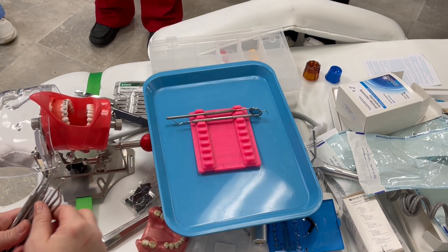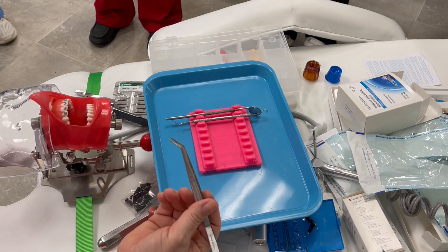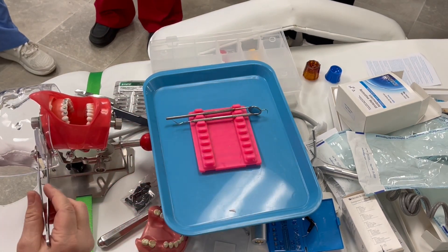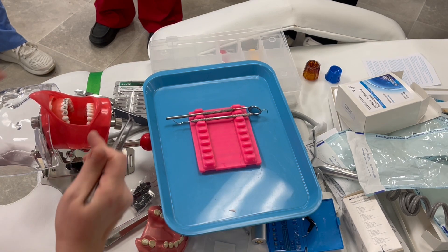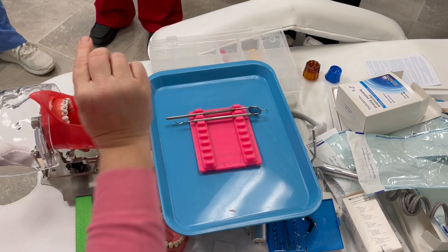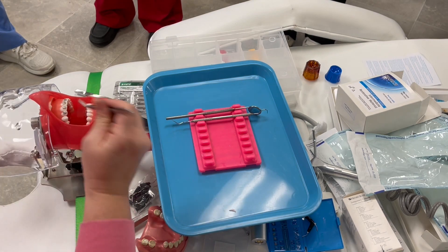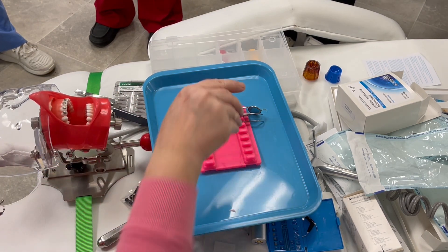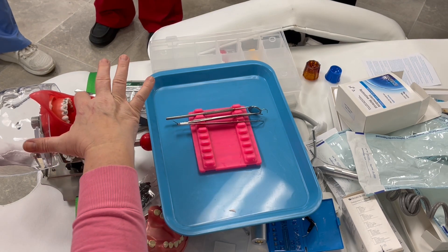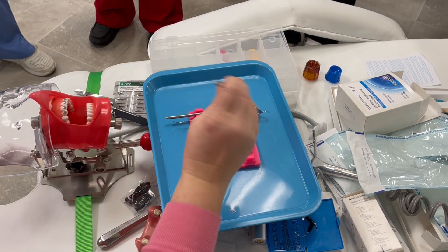So mouth mirror, explorer. What's the last thing in a basic setup? Pickups. What are they used for? Pick stuff up. So in ortho if you're doing a bonded expander and you press it up, glue is going to ooze out — we'd use three-inch or six-inch cotton tip applicators to get that out. But every once in a while some glue forms and you just pick it out. You also might have tooth fragments — if a doctor is drilling and the tooth fractures and you don't want it caught in the suction, use the pickups.